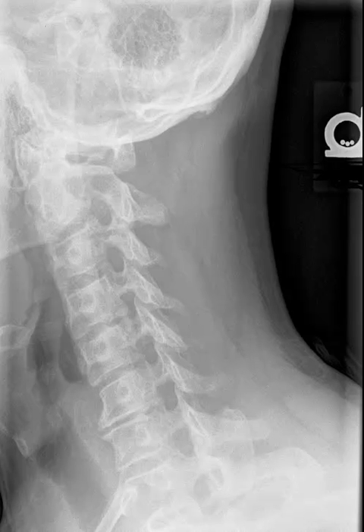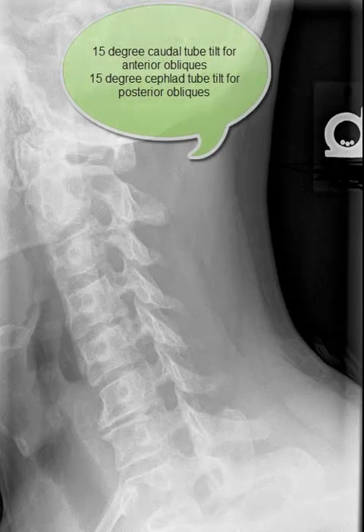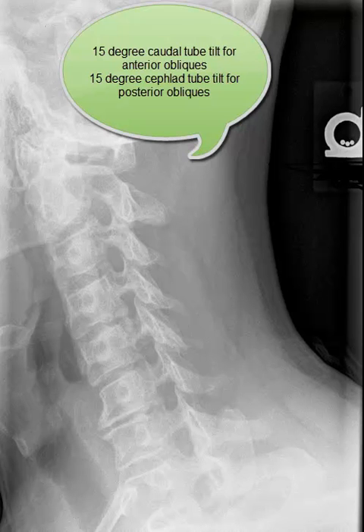Oblique projections can be taken in the AP or PA orientation. This will alter which direction your tube will be tilted — cephalad versus caudad. However, anterior and posterior obliques will end up looking the same when developed.